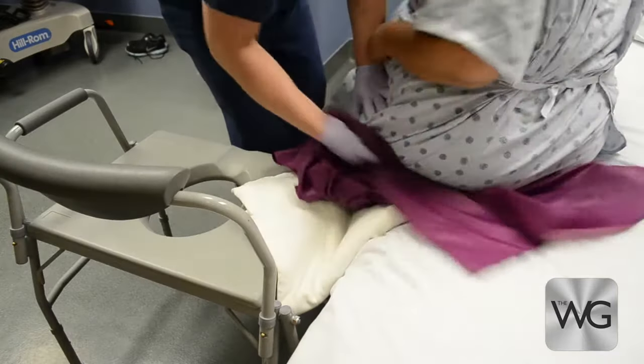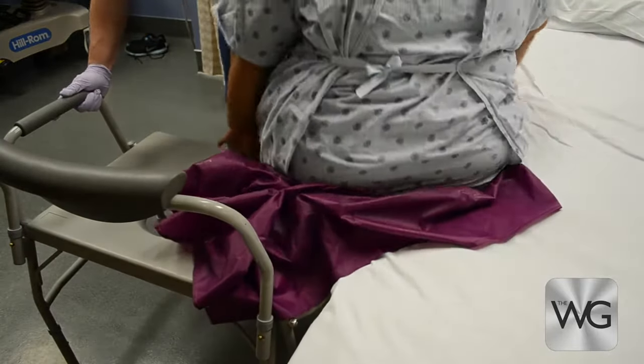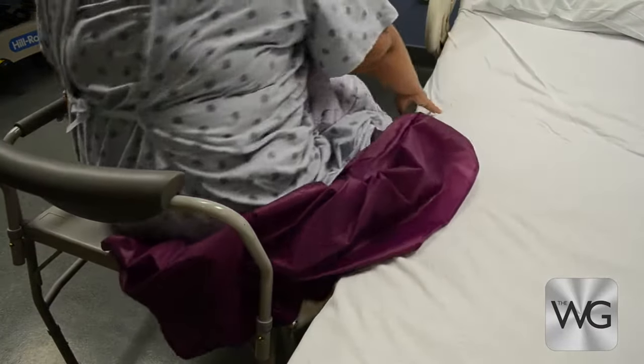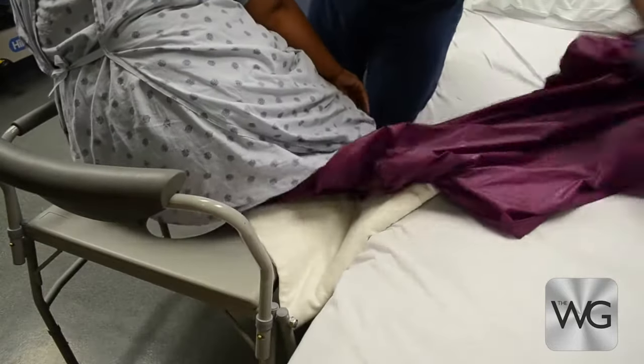The caregiver may need to adjust the slide sheet as the patient scoots to assist with the transfer. Once on the commode, instruct the patient to lean to the side, remove the slide sheet, and return the armrest.